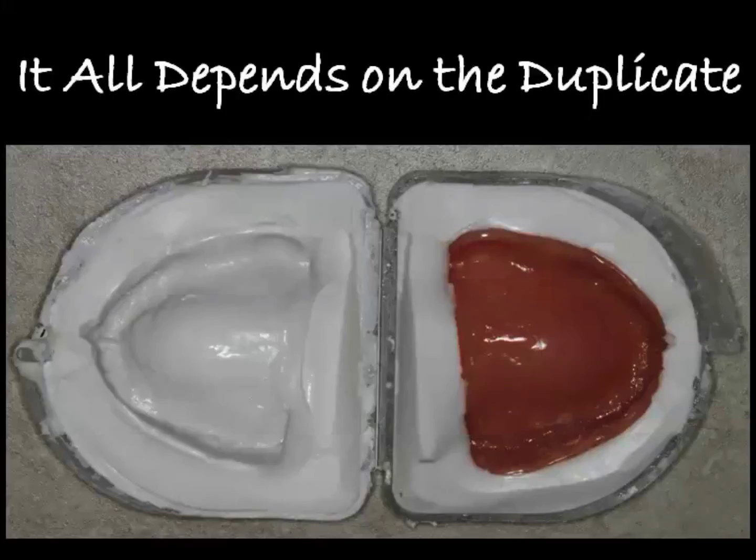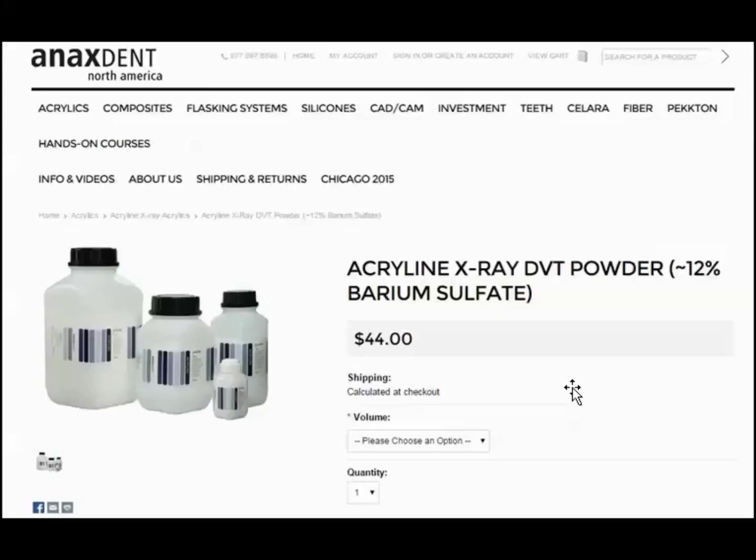The first thing you need to know is it always depends on a really nice duplicate denture. I've got techniques on my YouTube channel of how we use a standard lab appliance box to do a clamshell impression of a patient's denture. By using that we can make this impression and then pour it up in acrylic. The acrylic I use is from Anax Dent North America — it's a 12% barium sulfate acrylic. It sets up fairly quickly so it's really nice to do this in a single sitting while the patient is waiting.